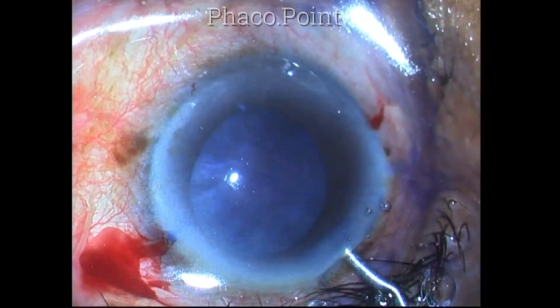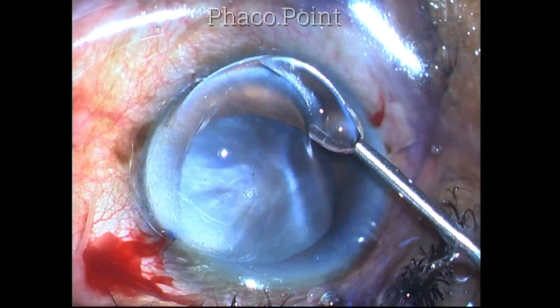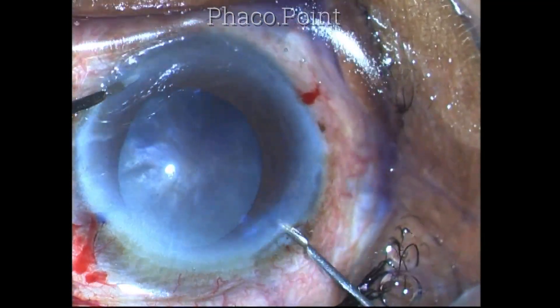In this patient I used only hydroxypropylmethylcellulose 2% for the entire surgery, in order to coat the epithelium as well as the endothelium.